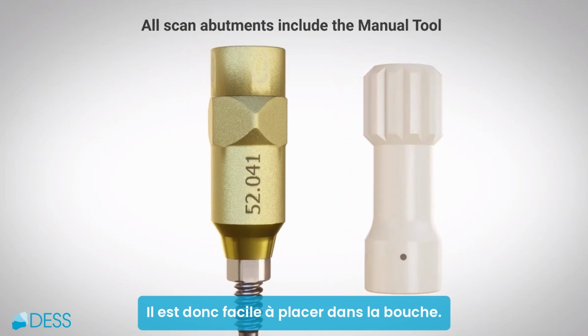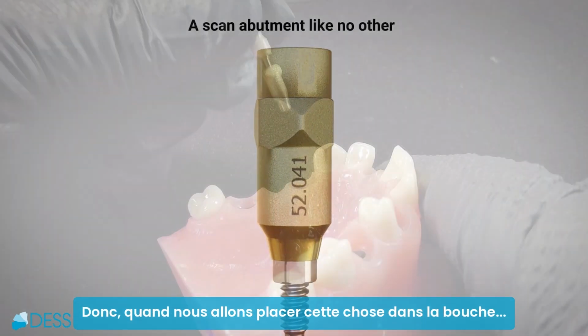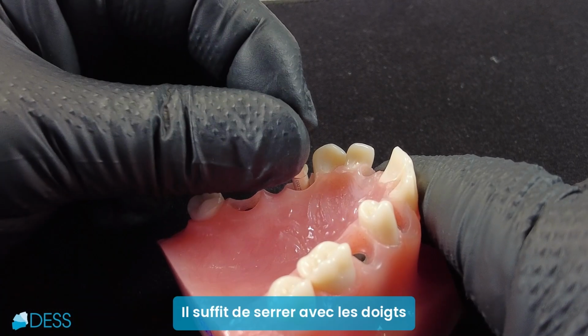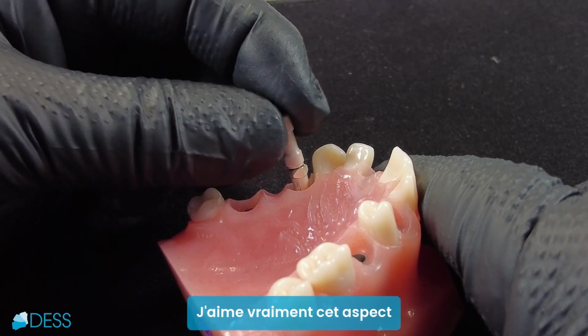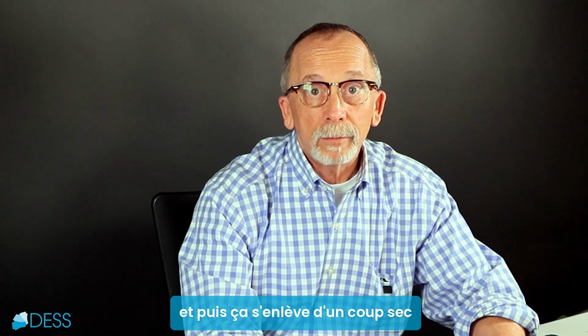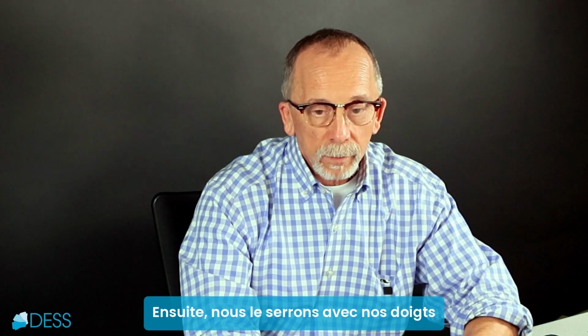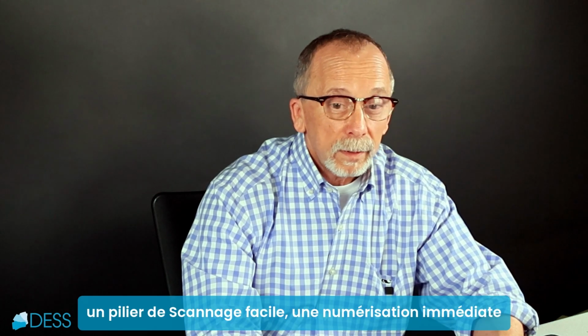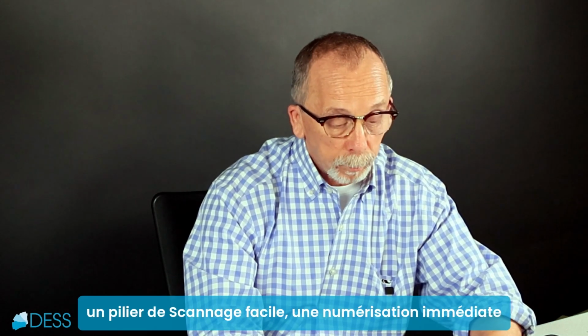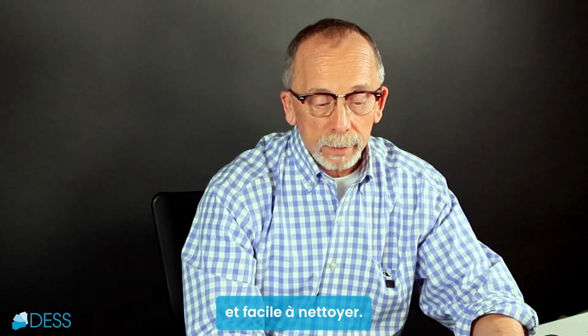So now it's easy to place in the mouth. When we go to place this thing in the mouth, it's simple: with our fingers, tighten that thing down. I really love that aspect of it. And then it just snaps off. We're ready to go. Then we tighten it with our fingers, and then we can start scanning. So it's an easy delivery, easy scan post to scan, and easy to clean.